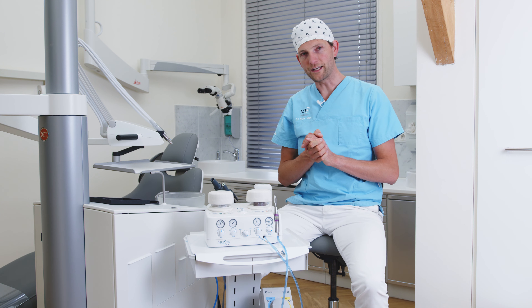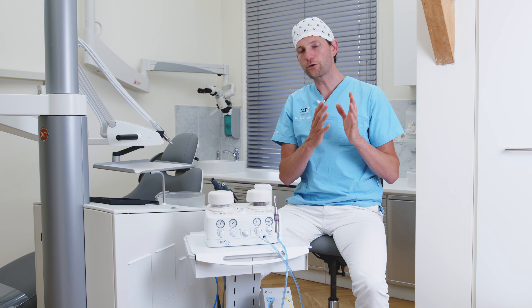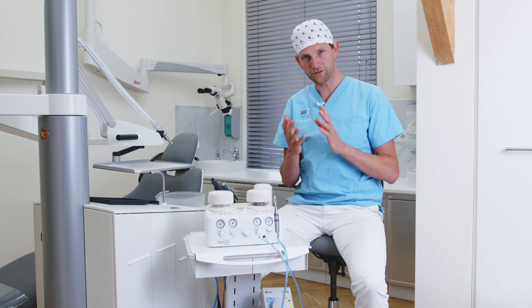Now let's talk about some clinical cases. In this picture right here we see a normal cavity preparation after excavation.